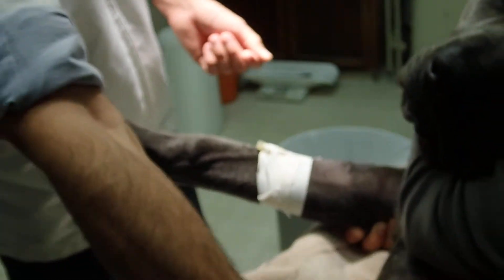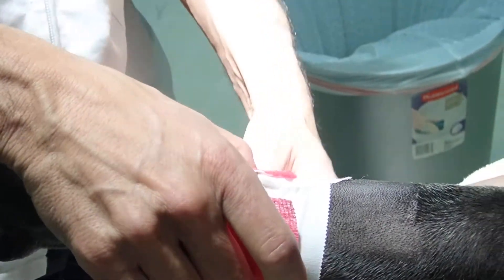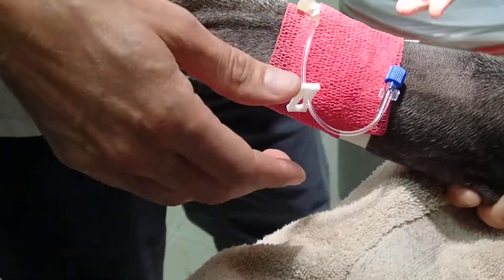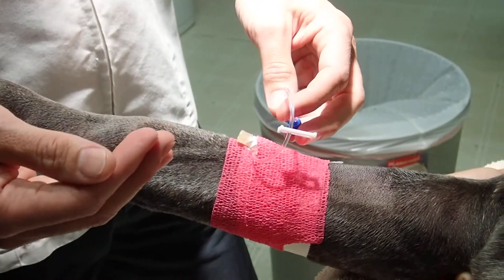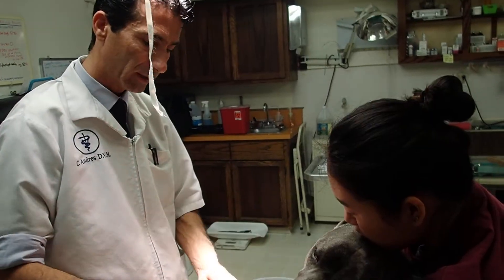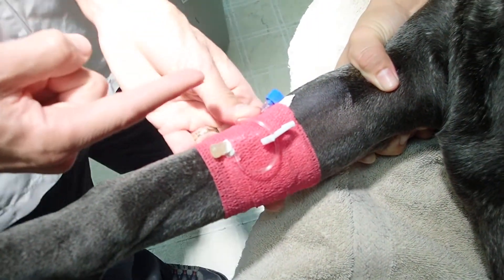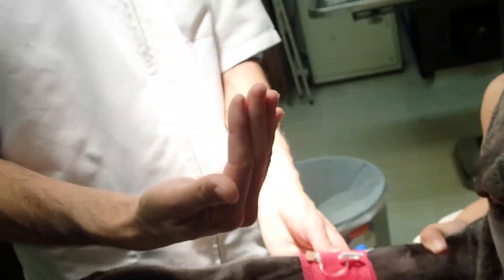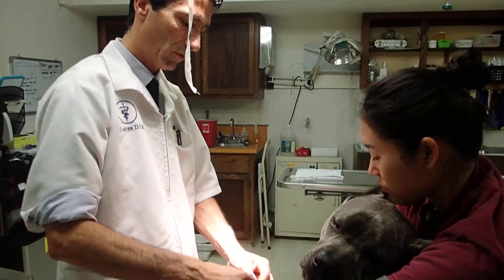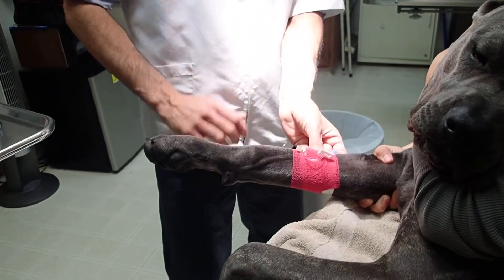Now I'm going to tape the vet wrap — I'll slide this underneath and wrap it around. What do we do with the T-port orientation? You have a couple of options. If we're working on the face — say we're doing dentistry — I don't want the intravenous fluid line around the muzzle the whole time, so I'll orient the T-port caudally so the IV fluid line runs caudally and stays away from the face. But if I were doing a spay or neuter, it doesn't matter, and you could orient it cranially. I tape it facing caudally just because I do so many dentistry cases — that's the way I prefer.